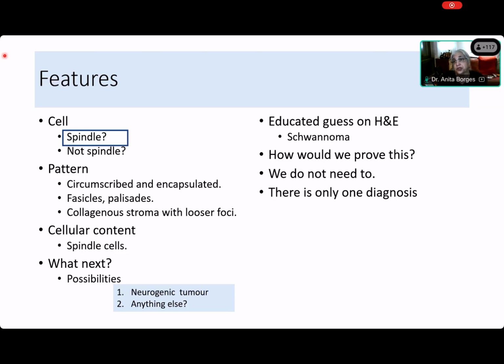There is only one diagnosis here. So I didn't agree with Kedar because all you students have DDs. You do not need a DD if there is no DD. What is DD, Saida? Differential diagnosis. Yes. So everyone wants a DD. You don't need a DD if there is only one diagnosis, and this is a schwannoma. Have you understood that, Saida? Yes, ma'am.